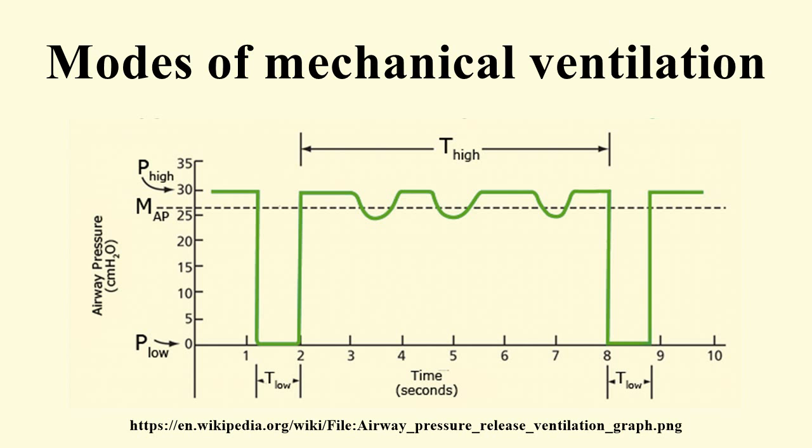Optimal: a targeting scheme that automatically adjusts the targets of the ventilatory pattern to either minimize or maximize some overall performance. Intelligent: a targeting scheme that uses artificial intelligence programs such as fuzzy logic, rule-based expert systems, and artificial neural networks. A mode of ventilation is classified according to its control variable, breath sequence, and targeting scheme. The preceding 9 maxims create a theoretical foundation for a taxonomy of mechanical ventilation.